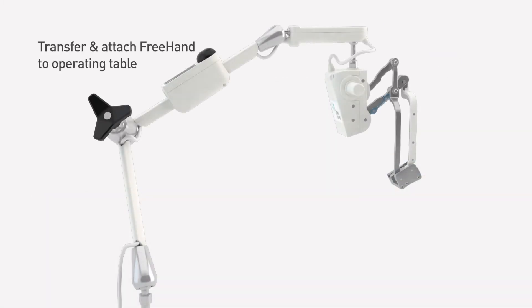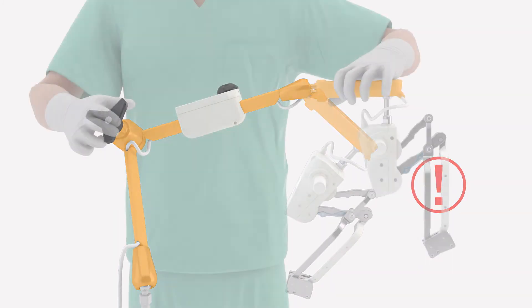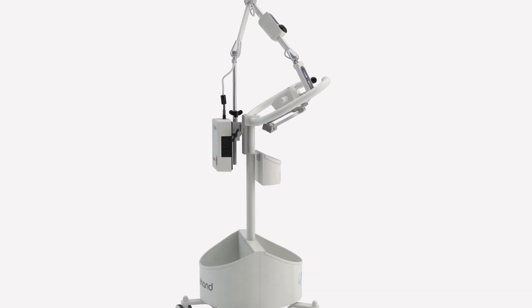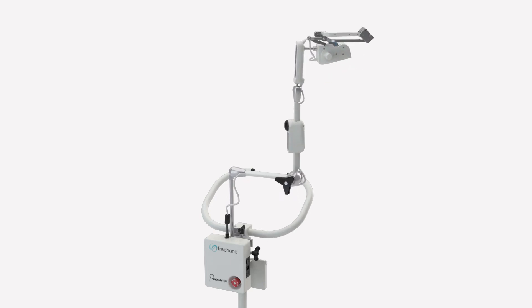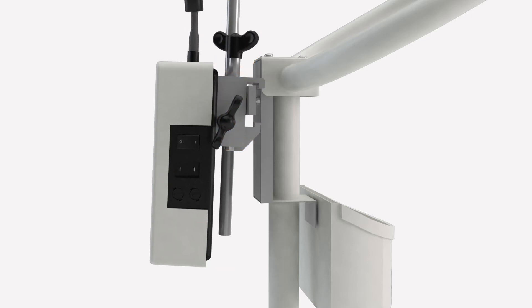Care should be taken throughout this process as the loosening of the freehand arm knob relaxes the tension of the entire arm. To avoid any damage, it is important that two hands are always used in supporting the freehand cobot. Adjust the freehand arm from the storage to the transfer position and then loosen the control box clamp to allow removal from the trolley rail.